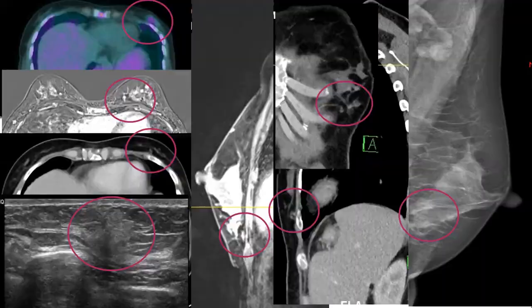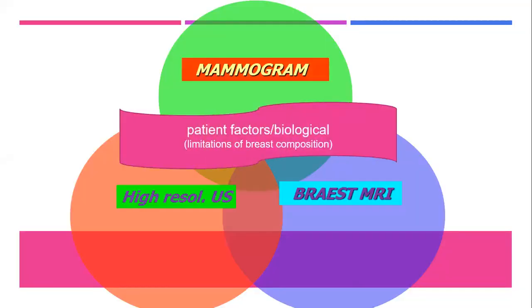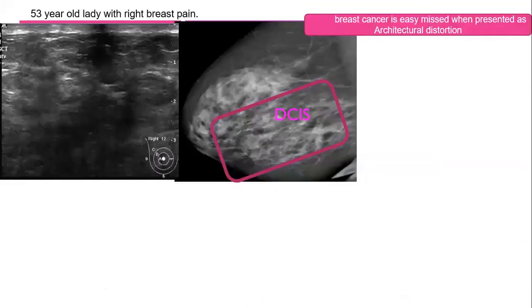Yes. Okay, so we discussed some of the patient-related factors. Let us go to the other factors.